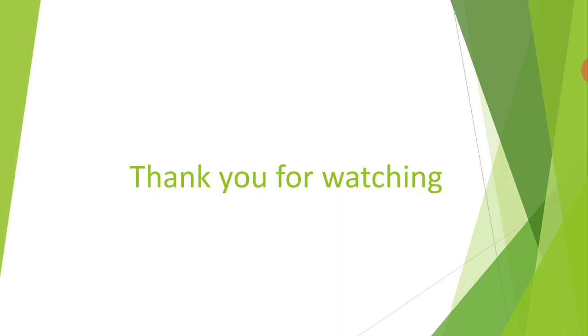Also, guys, family or friends can play an important role in encouraging the patient to keep trying. So relatives or family should really try to encourage the low vision patient to use the low vision devices. They can help, including with different types and positioning of the devices correctly, and you will train them to do so with a low vision specialist.